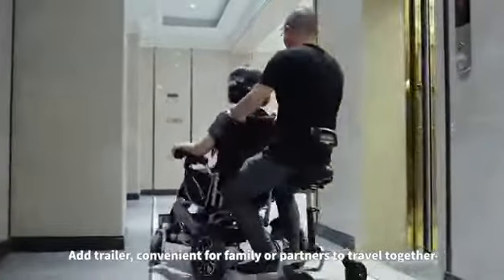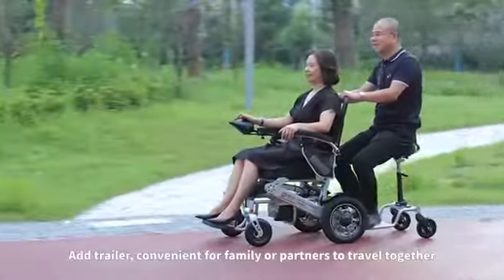Add a trailer attachment, making it convenient for family or partners to travel together.